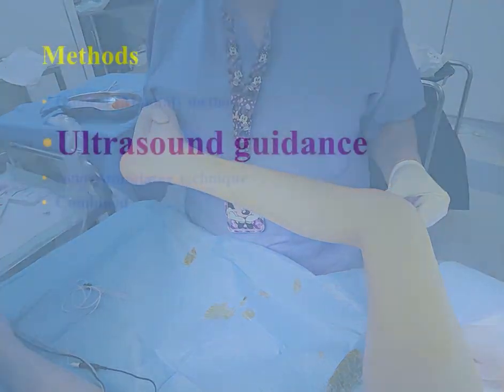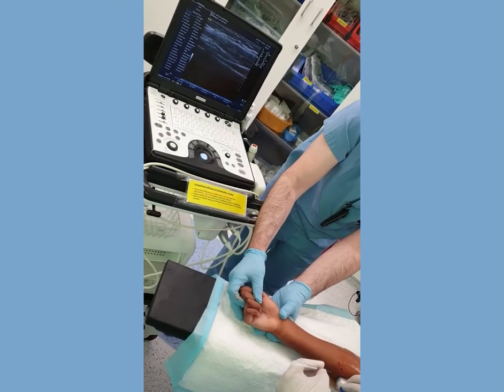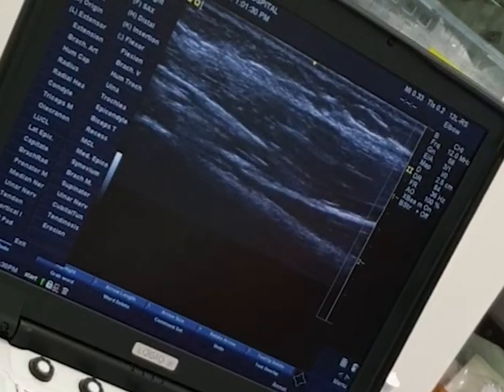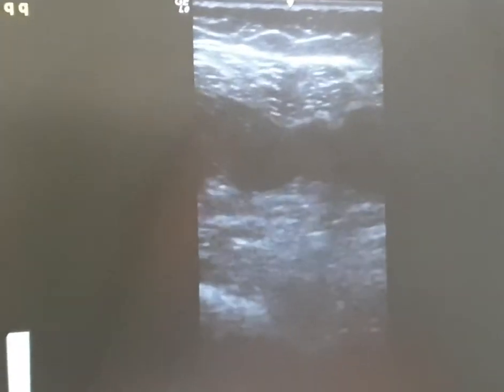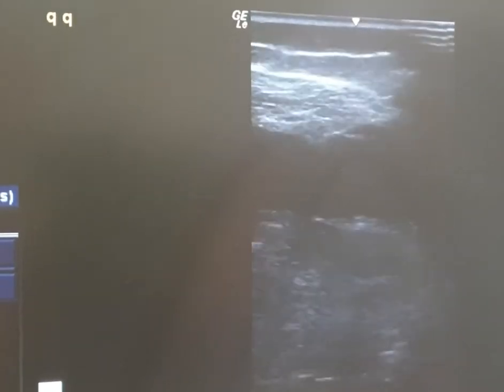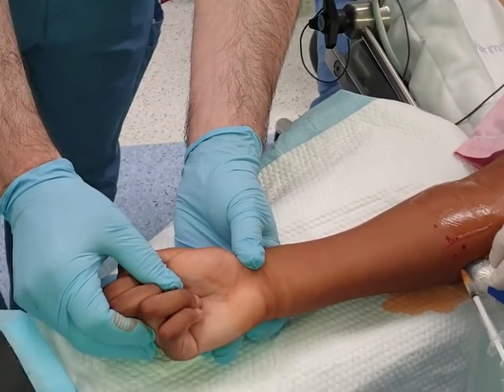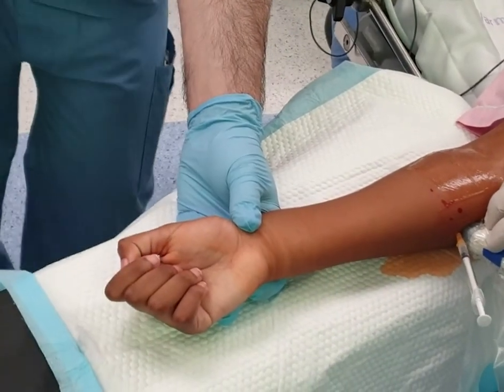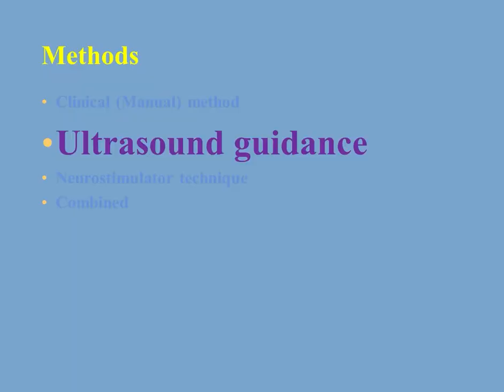To overcome this inaccuracy, ultrasound has been introduced to reduce error. Here I'm trying to inject the flexor carpi ulnaris. I use the ultrasound probe to identify the moving muscle by flexing the wrist into ulnar and radial deviation. Once identified, I introduce the needle under ultrasound guidance into the target muscle. We can see the tip of the needle entering the muscle. I then double-check using the clinical method — moving the wrist into ulnar and radial deviation — and as you can see, the needle is moving, confirming the tip is in the right place.